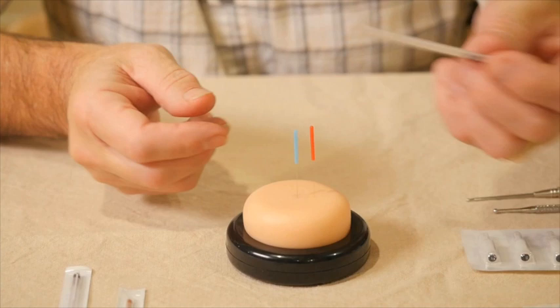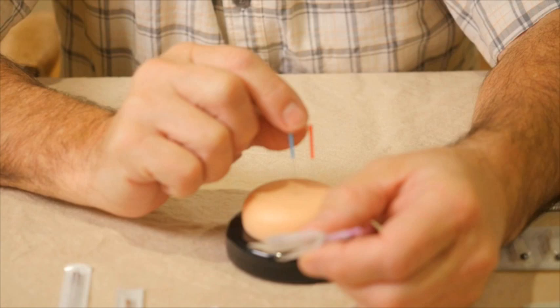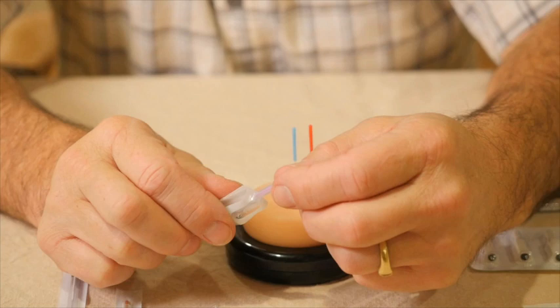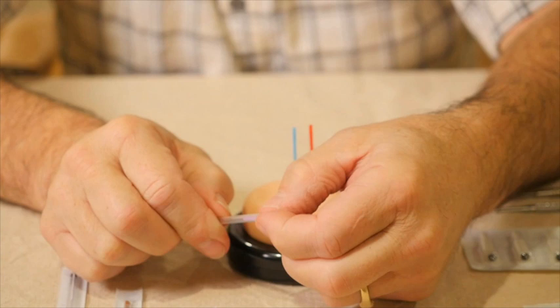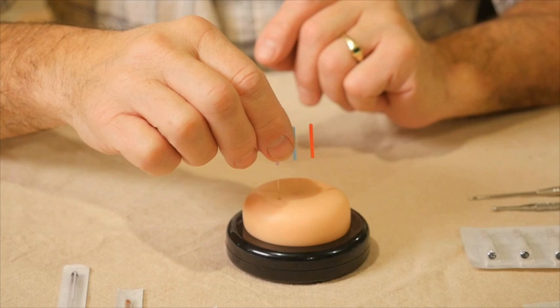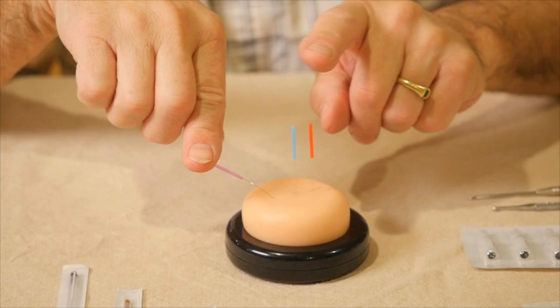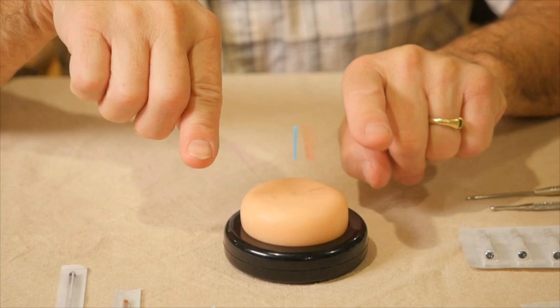This is a number 5 needle. The difference in thicknesses is very minor: a number 3 needle is 0.20mm in thickness, while a number 5 needle is 0.25mm in thickness. After breaking the weld and tapping the needle in, you can see that the number 5 stays fairly straight when bent, whereas the thinner needle bends quite a bit more.